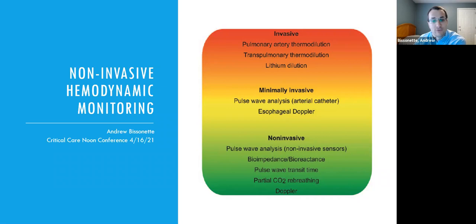But for those of you who don't know me, I'm Andrew Bissonette. I'm one of the new division of pulmonary and critical care staff physicians. And I was asked today to talk about non-invasive hemodynamic monitoring. So moving away from invasiveness has been a trend since the PAC-Man trial and similar trials, going away from PA catheter, more to arterial lines and central lines. And now we're getting less and less invasive to the point that we don't even have to insert any lines at this point in some patients and in some instances. So I was asked to kind of give us a review of where we've been and where we're going.